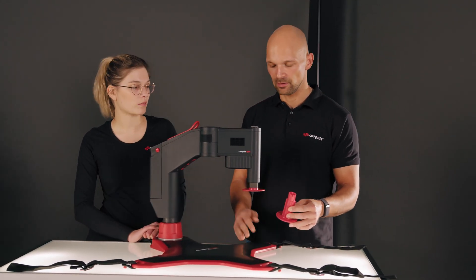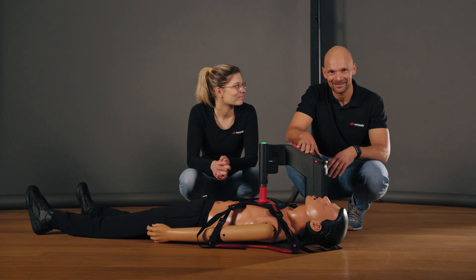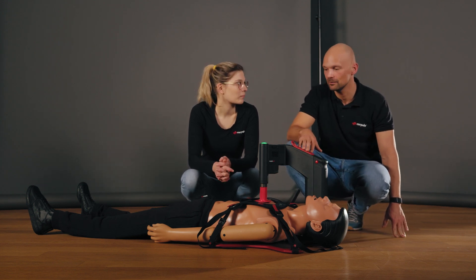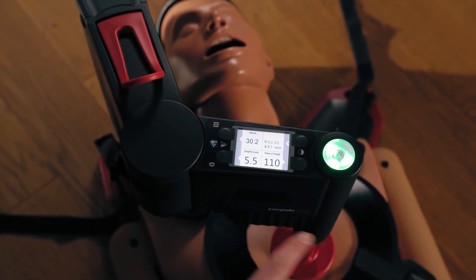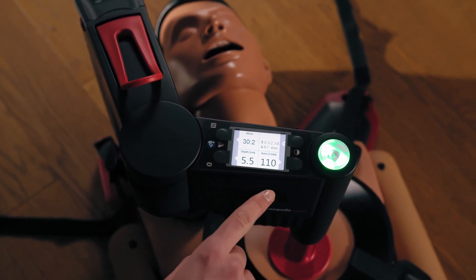If there are still problems despite choosing the stamp length, we would refer you to our troubleshooting video. As the resuscitation mannequin has a low thorax height, we are using a long stamp and Verena will now show us how we can change the therapy using the soft keys. We can see that the Corpus CPR display is divided into four sections, with only one section focusing on the times and the other three giving options to change a therapy.